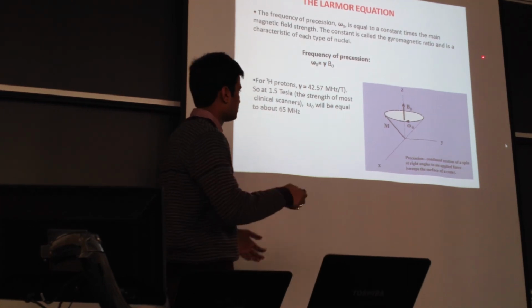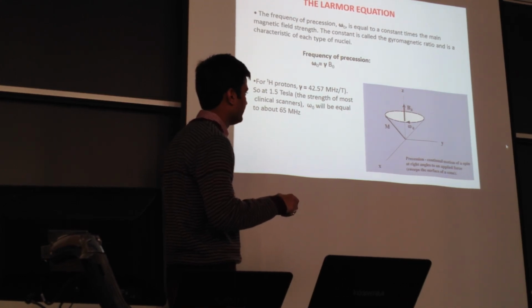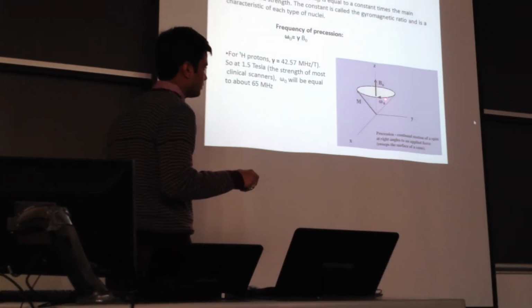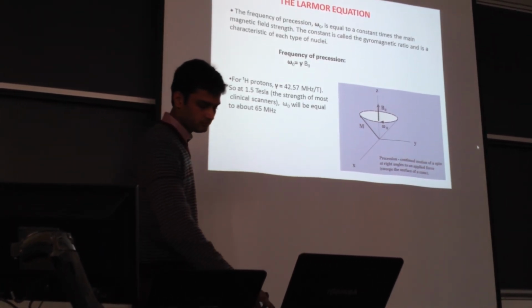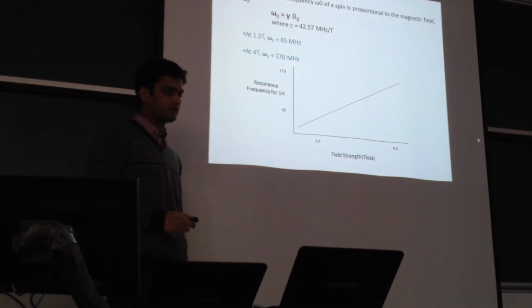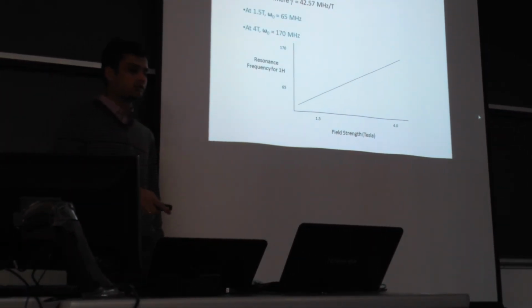So this shows, as we said, this is the Z longitudinal direction, the same direction as the external magnetic field. This is the pattern in which the precession occurs, and omega 0 denotes the frequency at which this phenomenon occurs. As we said, omega 0 is directly proportional to the magnetic field. So for any given value of the external magnetic field, we can determine what's the resonance frequency.